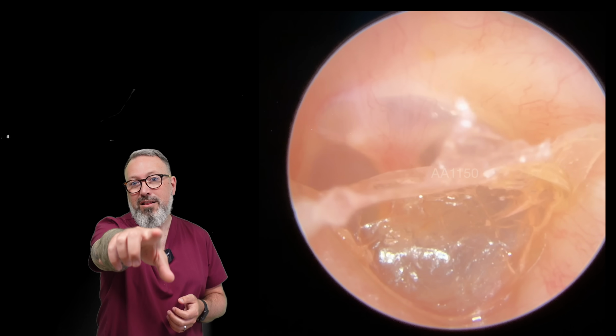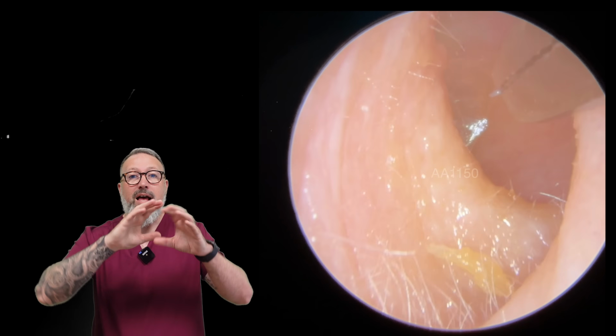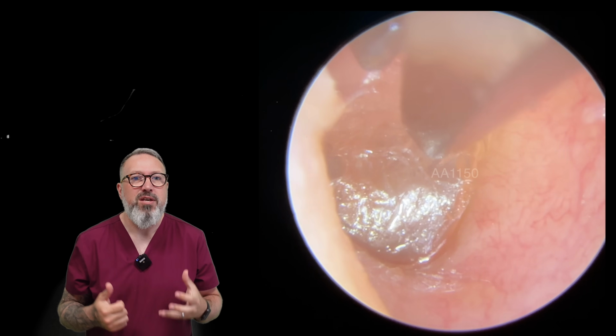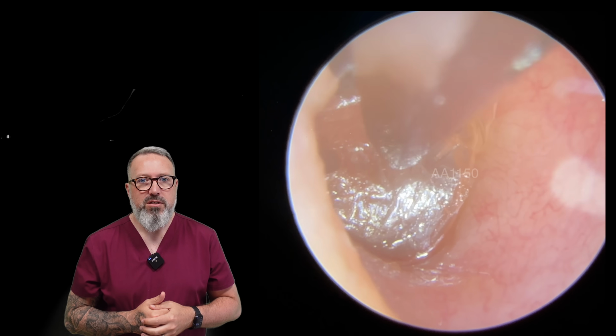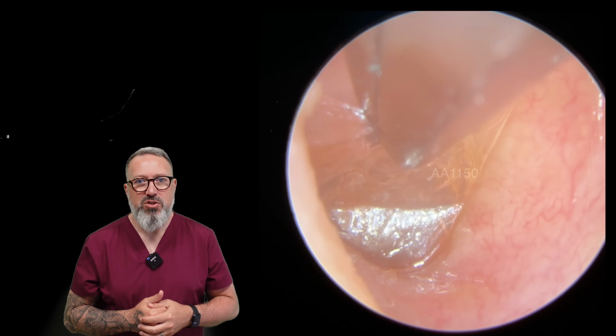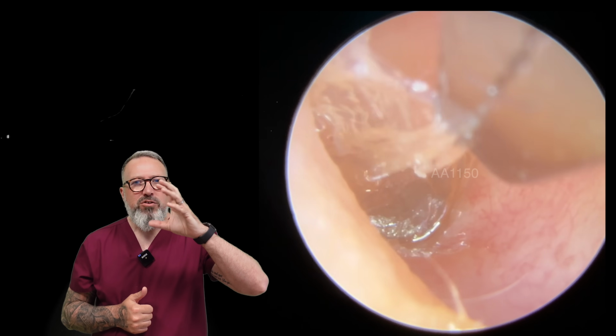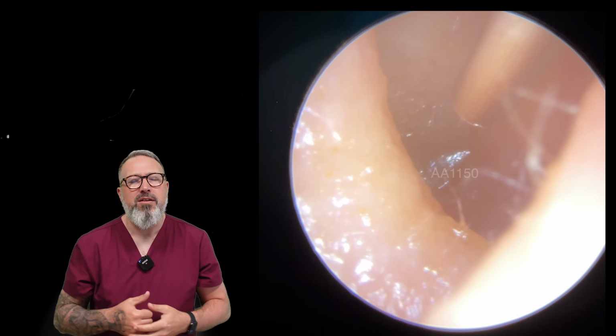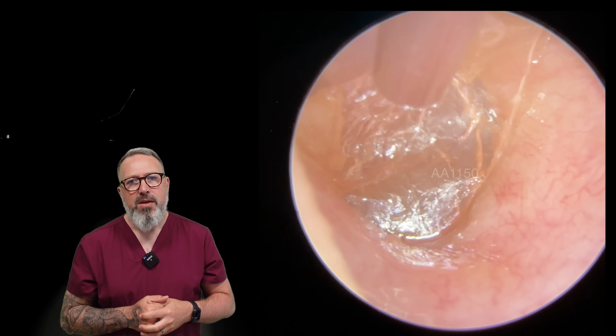But look at that layer that had built up over the eardrum. It looked almost like a secondary eardrum in there. But we're just going to see if we can grip this section. But it's so paper thin, it's almost wispy in its consistency, almost like a cobweb kind of effect. So I've got the fine end on here now. Let's see if we can just draw.